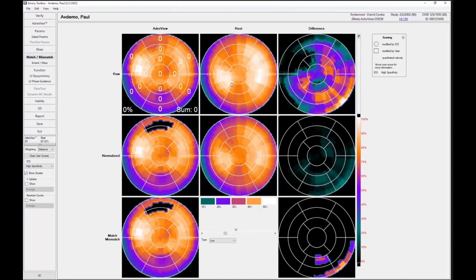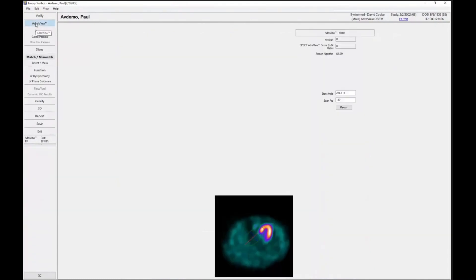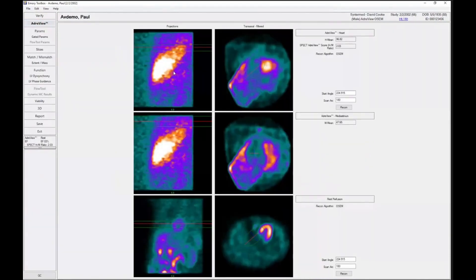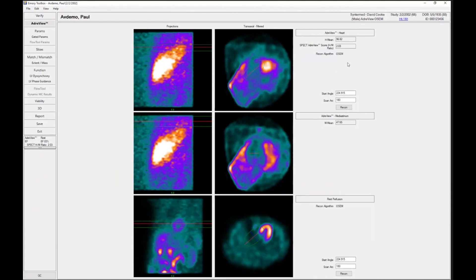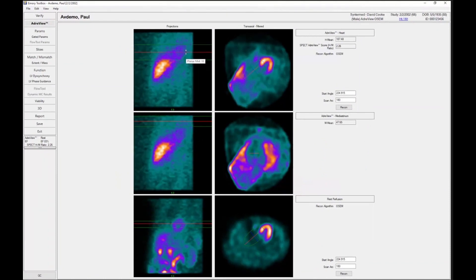So that's one method of doing the AdReview quantification, but we also can reconstruct the actual AdReview planar projections and then do a heart-to-mediastinum ratio based on the SPECT study.